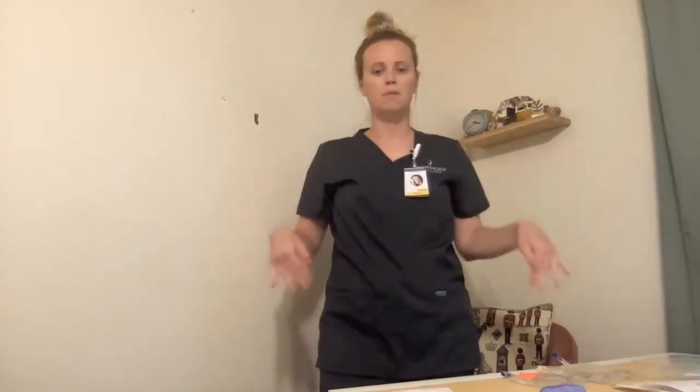Hi, my name is Emily. I'm going to perform this skill video on IV Fluid and Medication. I'm in the appropriate school attire. Badge is visible, no polish, no jewelry.